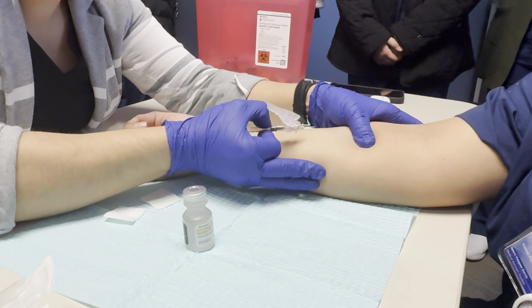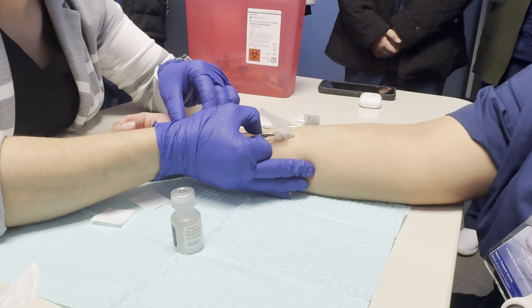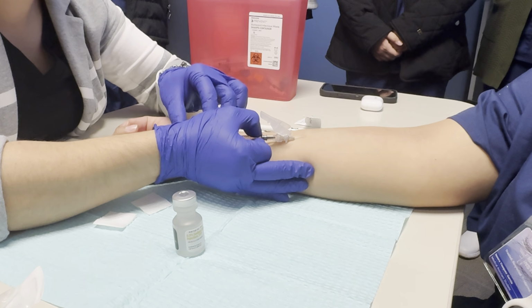All right. You got this, babe. So very, very tight, and take a deep breath in. And that's it. Okay? So from here, guys, you see how I let go of my other hand? Now the tip, only the teeny tiny tip of the needle was on.